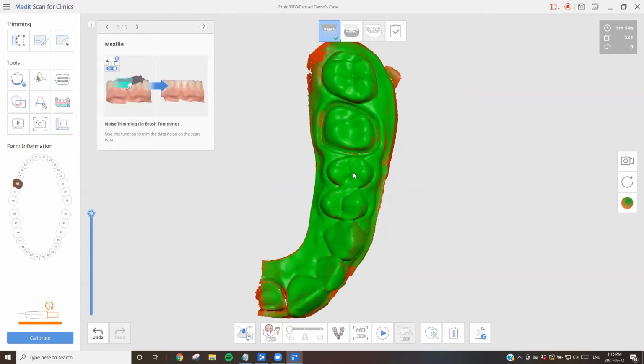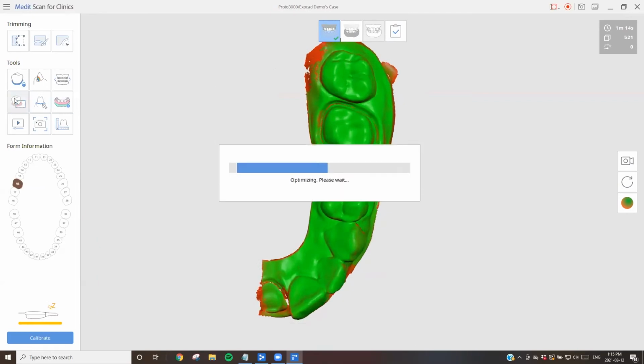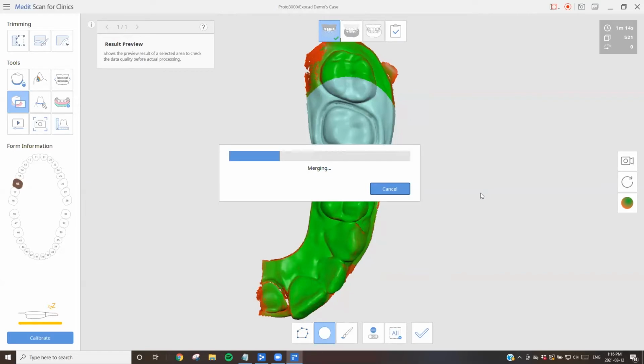So in order to process this unvoxelated file, it does take a little bit of time. And what you really don't want is to go to the process file and realize, oh, there's a bit of missing data on the margin, and you send the patient away, and then you're like, oh, Mr. or Mrs. Jones, can you please come back? I need to rescan. So if I was to quickly give a result preview of the margin, this is going to allow me to see what the final STL file is going to look like on a particularly sensitive area, margin, contact, and things like that, that you need the lab to have for a good restoration.